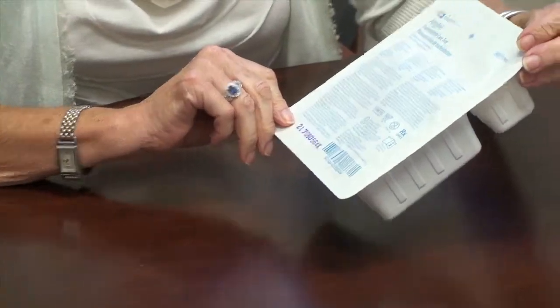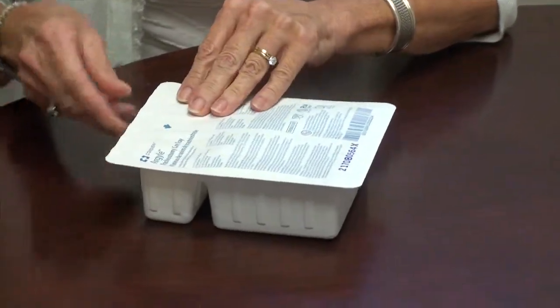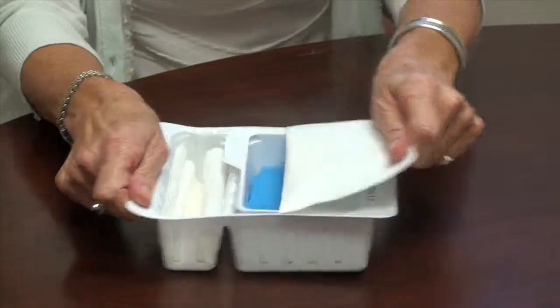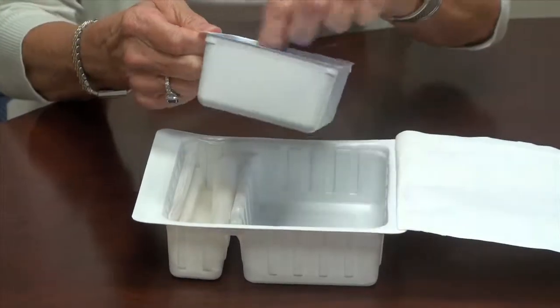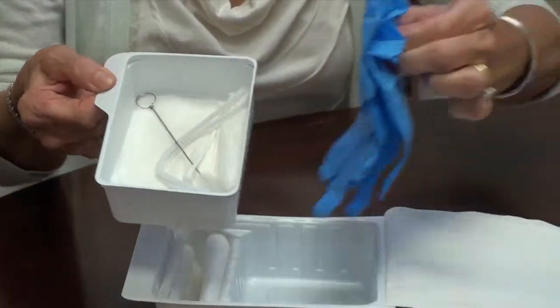This is the tracheostomy care tray. I'm not totally using full sterile technique to open this — it's more show-and-tell of the kit itself. When you open it up, you will have a tray inside that has your gloves in it, and you can take your gloves out and put them back in the tray if they're still sterile.